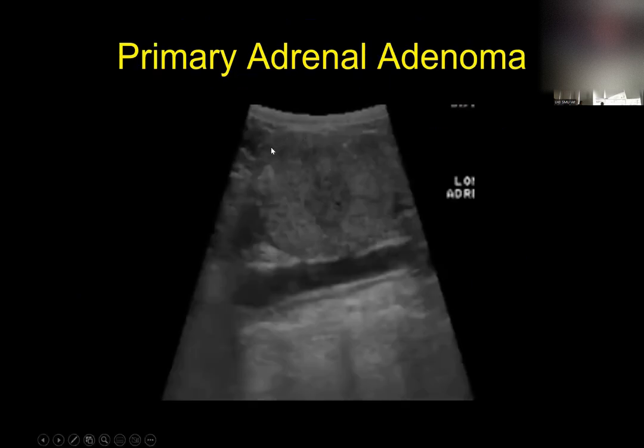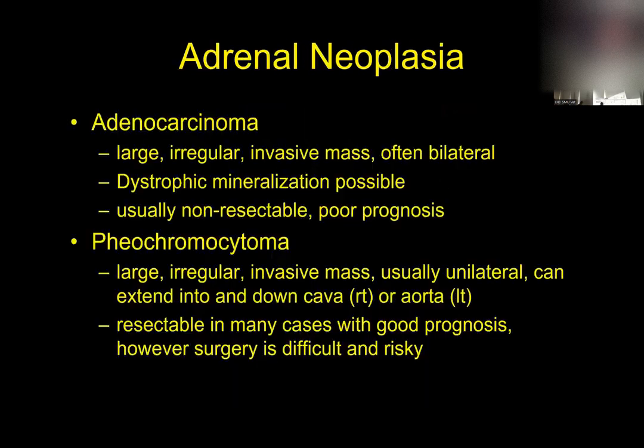So with adrenal dependent Cushing's disease, this is an adrenal gland here next to a blood vessel. And that adrenal gland is huge. It's big and rounded. It's not peanut shaped. It's not oval in shape. It's a great big rounded adrenal gland. And if you would go look at the other side, it will be normal in appearance or really small. Okay, so that's the difference when you're looking for adrenal dependent versus pituitary dependent Cushing's disease.